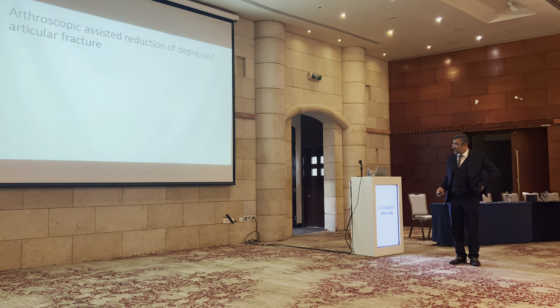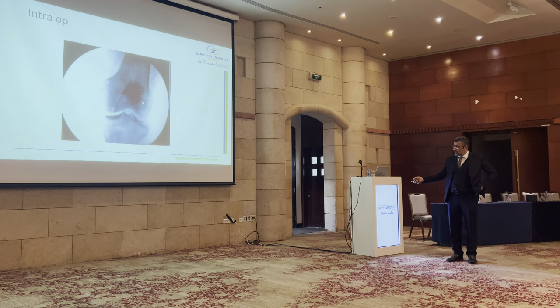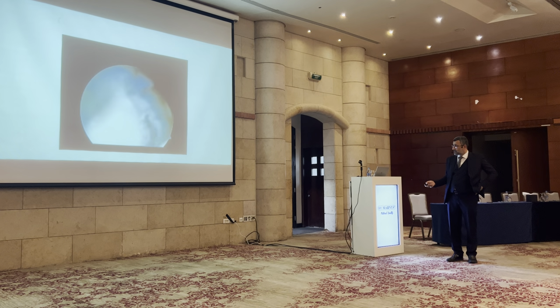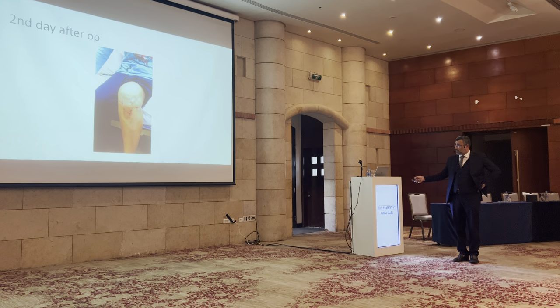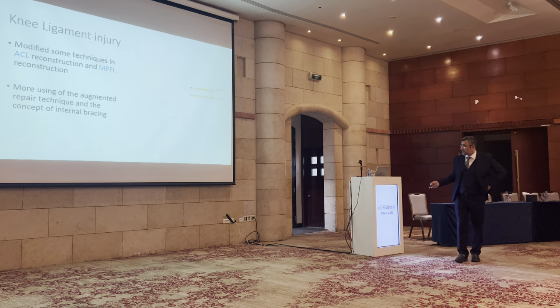Now, we can compare. Now, arthroscopic assisted articular fracture. This is the present fracture. We use again arthroscopic techniques to elevate the articular fragment. You see how it's depressed here, after gradual elevation. And then also fluoroscopic assisted, reduced, fixed, and now here, injection of calcium phosphate, which is not considered like other calcium phosphate. And you see after injection of this, we check if there's any leakage inside. And here the result, look. Restoration of the articular surface, early function. And we allow for pain relief. So proper techniques, proper reduction, stable fixation allow patients early recovery.